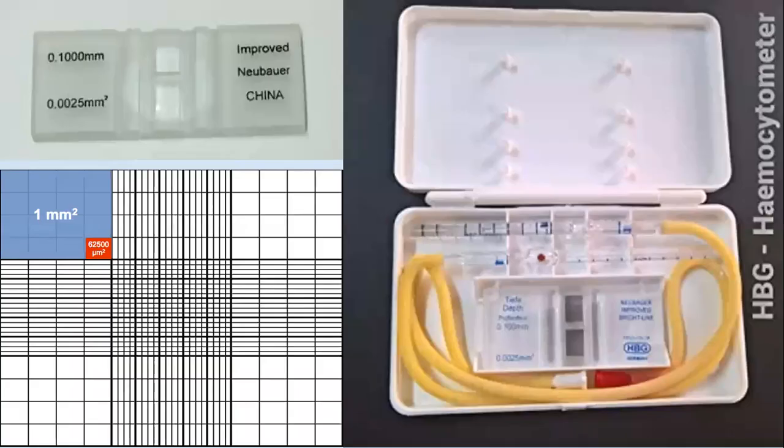These are the diagrams of images which we need during the practical. This is the hemocytometer box which contains an RBC pipette, a WBC pipette, and a Neubauer chamber. Under the microscope we will see the Neubauer chamber as shown.